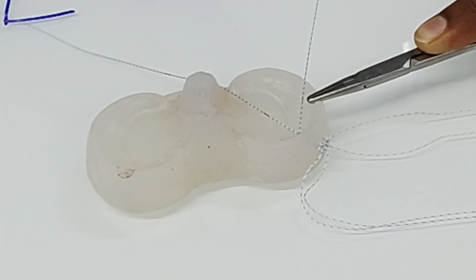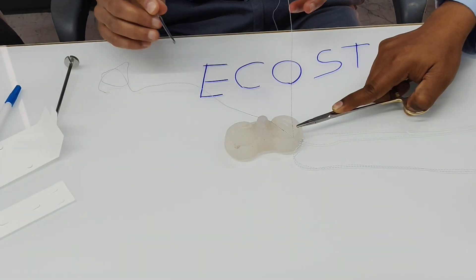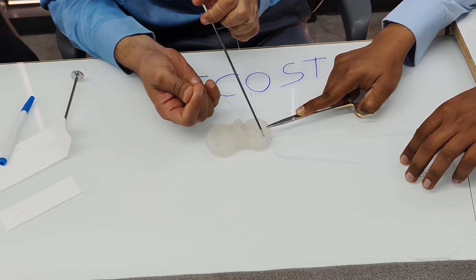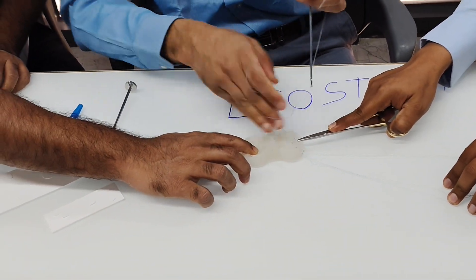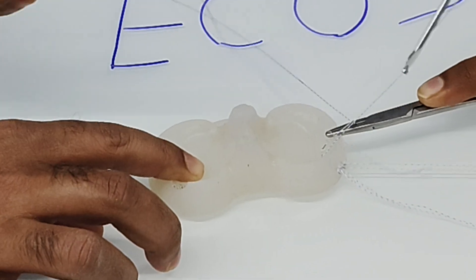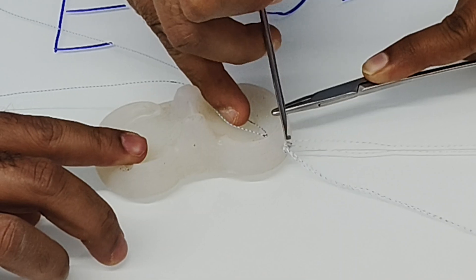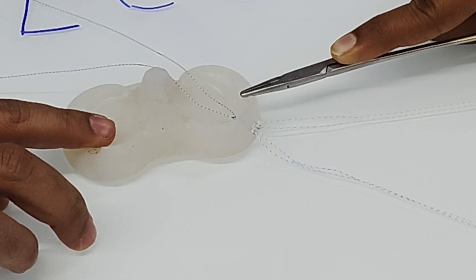When you tension it firmly, both anchors are tensioned on the posterior aspect of the knee, and the tear is approximated. There is a self-tying knot here, so you can leave it at this point. However, personally I use a knot pusher and tie two more security stitches to secure the knot in place, giving a very nice, secured fixation of the anchor.